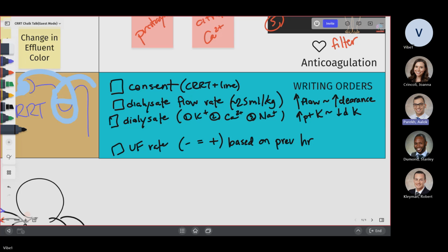The other thing, remember, is when you're treating... Dr. Kumar, somebody. Yeah, go ahead. What about when we want to give blood products through the CRRT machine? Isn't that possible, and is that easier? So the problem here with the CRRT machine is anytime it just increases your chances of the machine getting clotted.